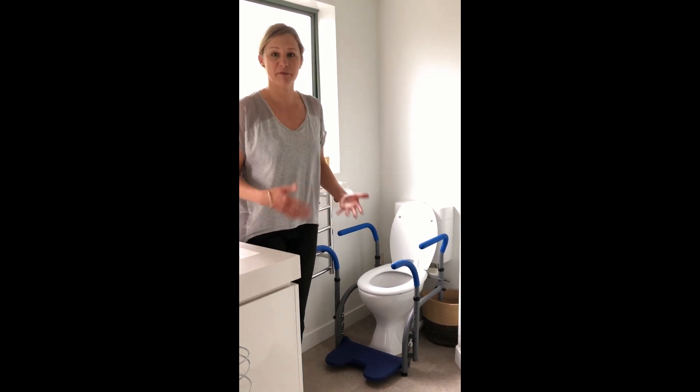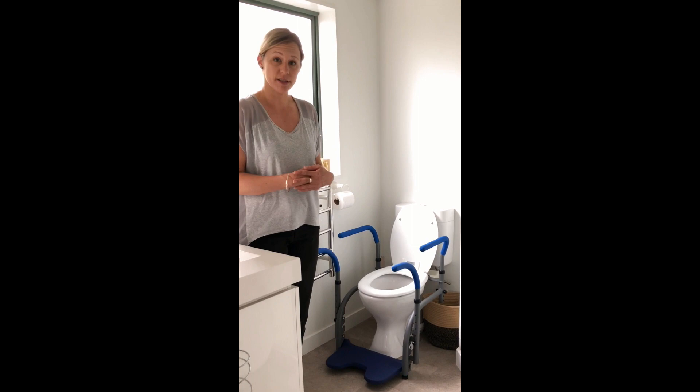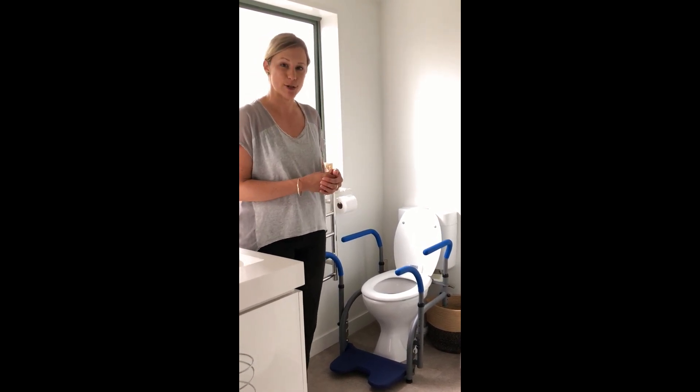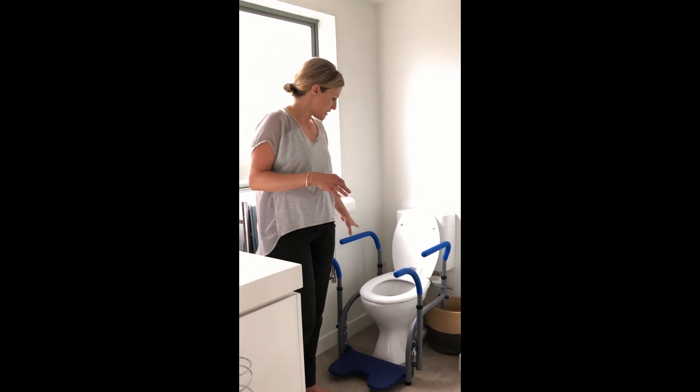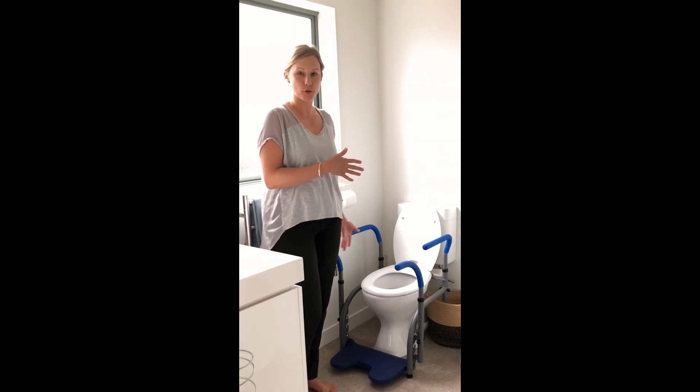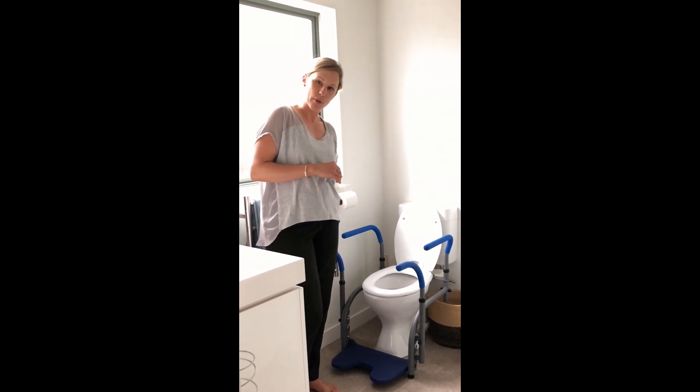Particularly children who may have behavioural concerns who need that extra security when sitting on the toilet, as it's got some brilliant functions which I'll show you soon. With the bars, it comes in a 4-bar or a 2-bar option. This is a 4-bar, so I'll just show you how it works.